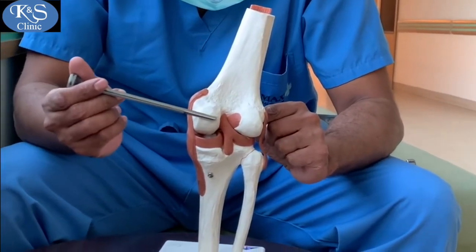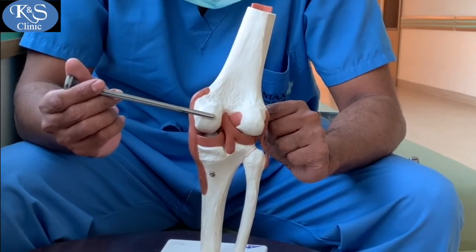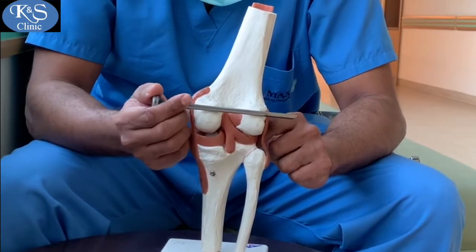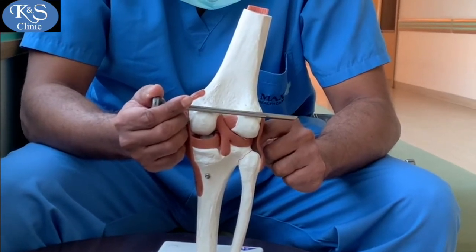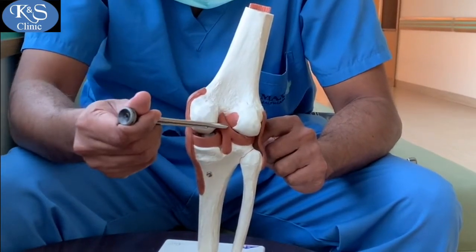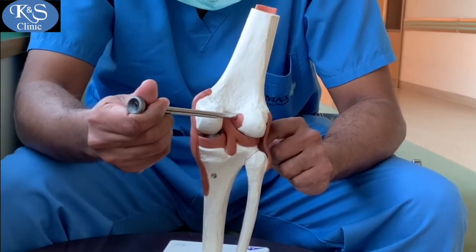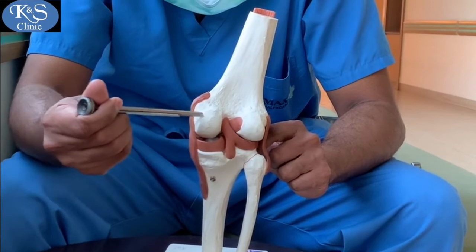Then under vision, a posterolateral portal is made after removing the septum, which is at the back of the knee and at the center, dividing the posterior compartment into two halves.